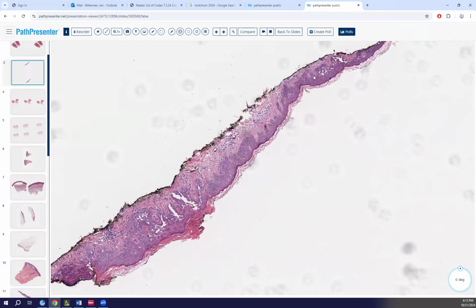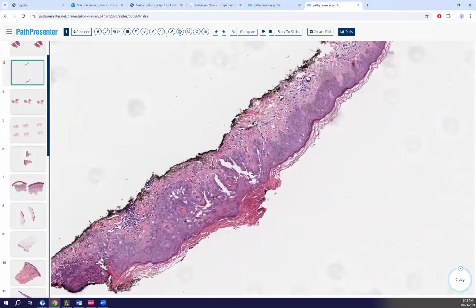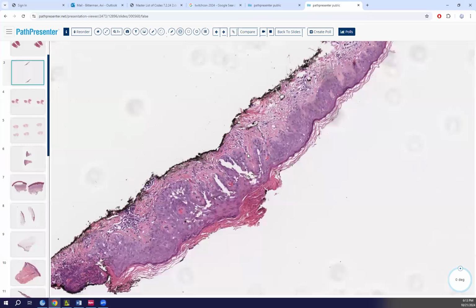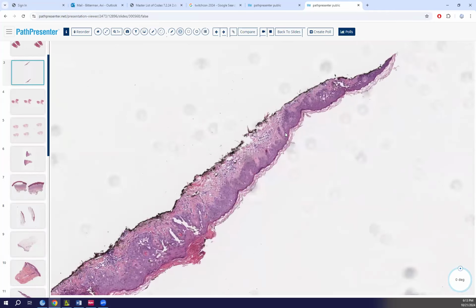Doesn't look like a warty dyskeratoma. Good. So we can take that out. Hailey-Hailey is like the dilapidated brick wall, which I suppose this doesn't look so much like. And in Hailey-Hailey, do we see more acantholysis or more of the dyskeratosis part? The acantholysis, yes.